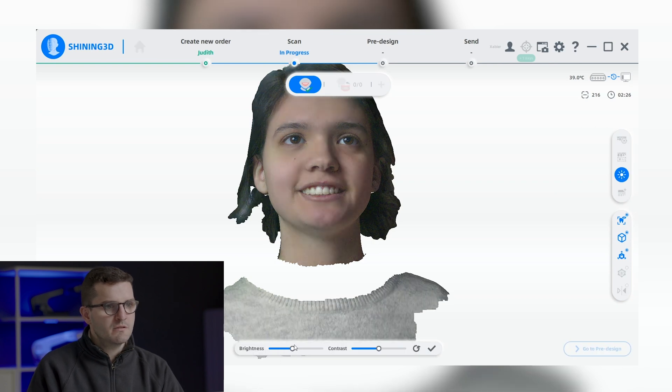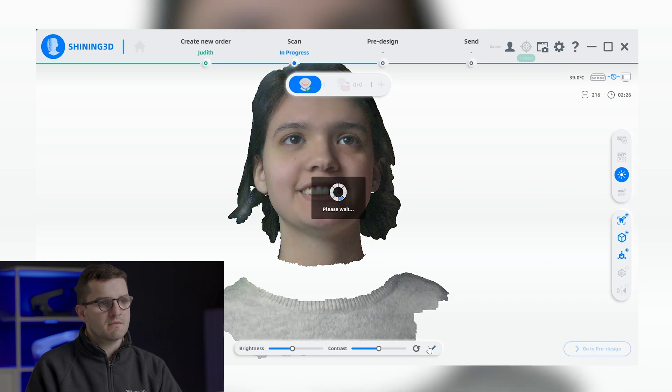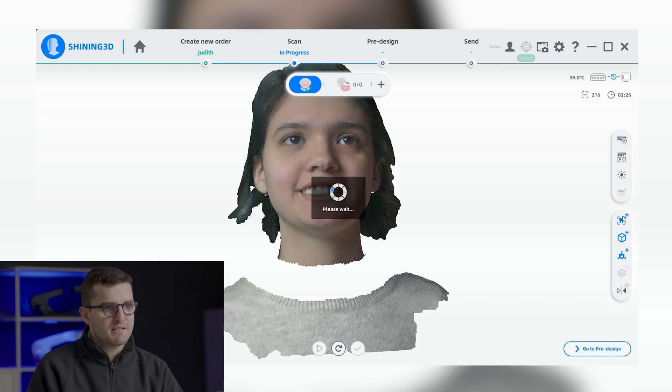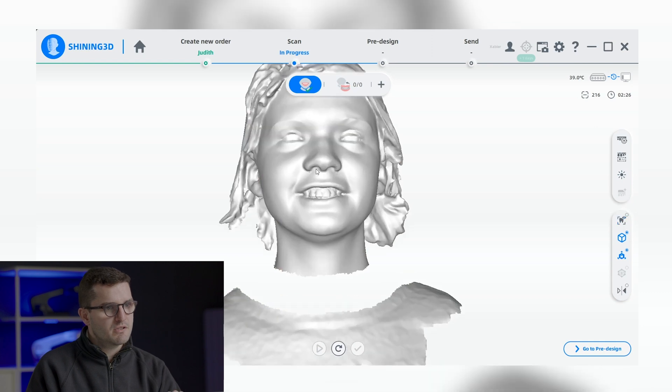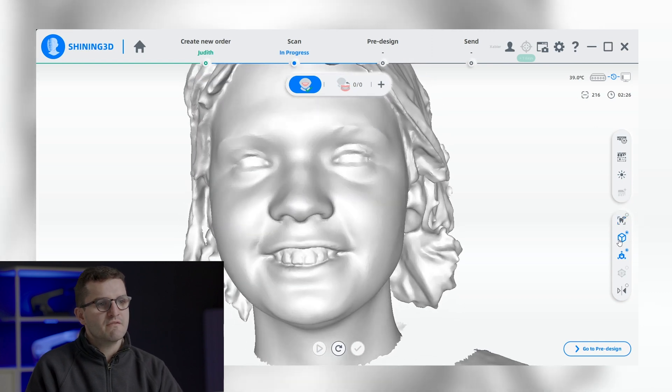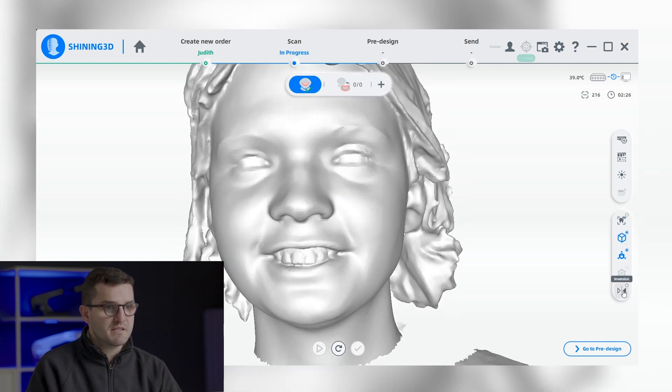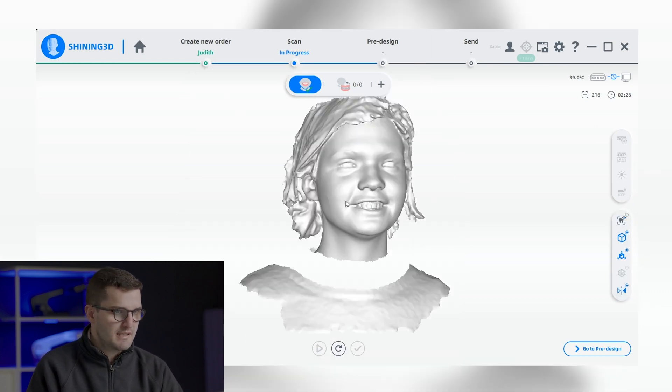In addition, users can remove the texture, adjust the perspective, block the view, and even invert the scan to gain a different perspective of the scan data.